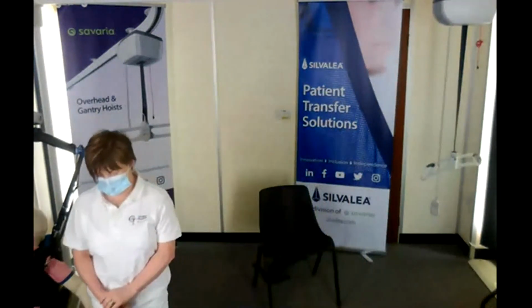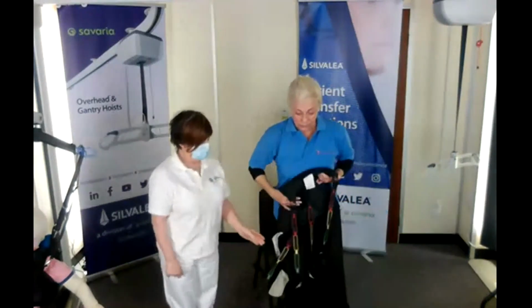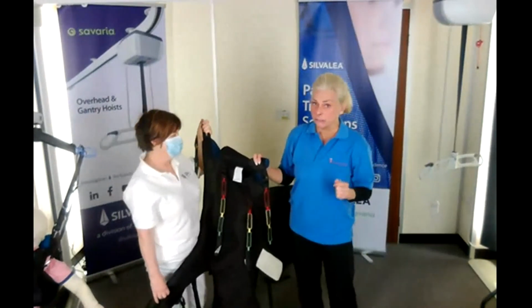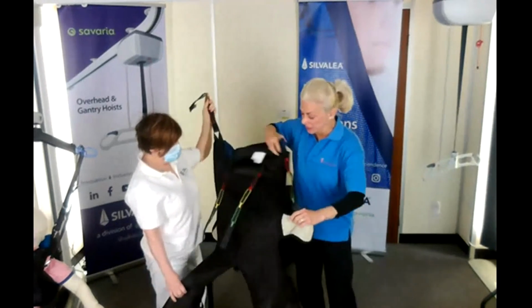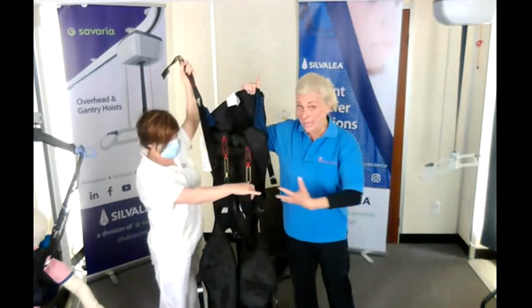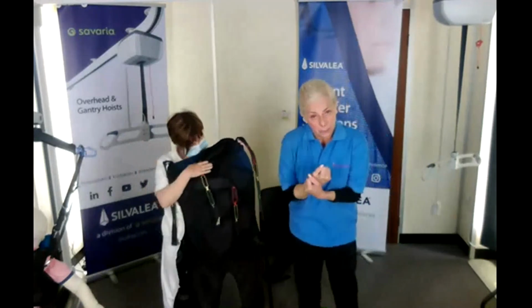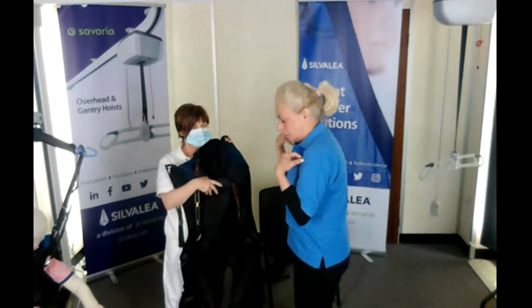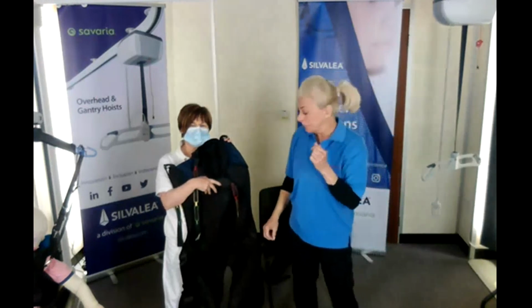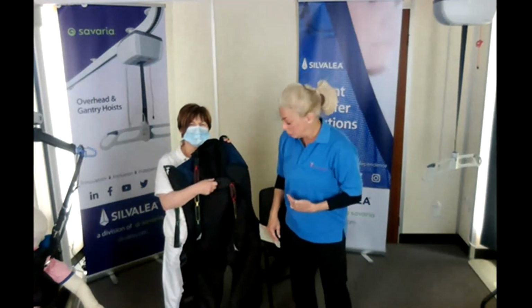The final sling is our Tinkham. So the Tinkham is the ultimate, really. We were faced a few years ago with a very challenging situation whereby somebody escaped out of everything. So had lots of movement, very active. So we came up with this design, which looks to be a little bit of a monster here, but basically it wraps around the body. So you wear it. And the idea was trying to break up the extension. So by features on the sling that would help to protract that person by bringing the head forward, protracting the shoulders and keeping them locked in a position that prevented them from this and escaping out. So, it looks like there's a lot going on, but certainly by doing it slowly, then we can gradually fit it.